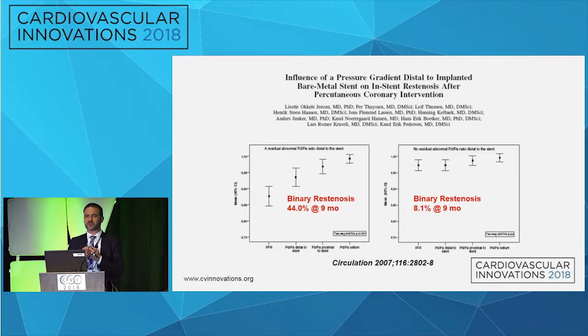And lastly, I would say again, the point of subjectivity. There is a lot of subjectivity when it comes to dissection assessment. And I hope that we can evolve and be more objective like we have done in the coronary anatomy, where we are doing pressure gradients, we are addressing what is the residual stenosis. So this is a paper from coronaries showing the residual gradient beyond stents in the coronary bed. And these are all normal FFRs, right? They're all above 0.8.